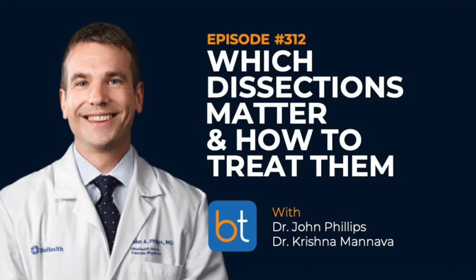Is the deployment mechanism for the tack, you kind of mentioned this, but is it complicated or is it pretty simple? Can you walk us through it just for listeners? Yeah, sure. So basically, let's use the big one, the 4 to 8 millimeter sizing lumens. You get 6 tacks on the catheter, and it's a pin and pull system. Under fluoro, or having talked to the rep ahead of time, you have to understand there are a lot of markers, and the catheter itself is kind of busy. The radio-opaque portion of the tack is actually in the middle of the two crowns.